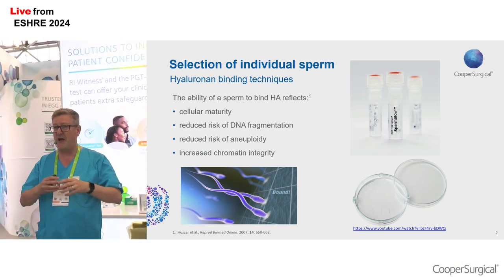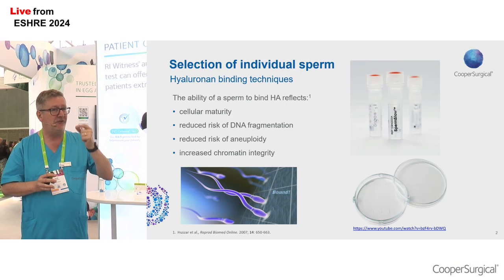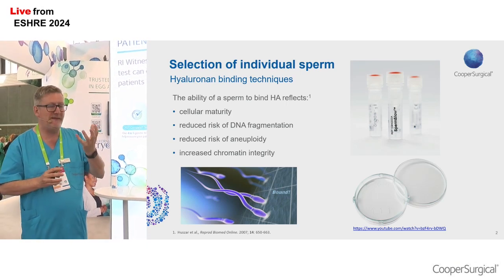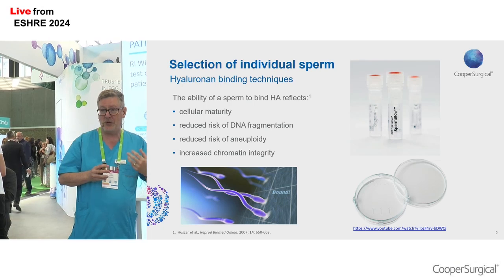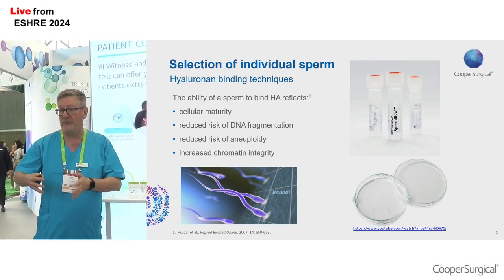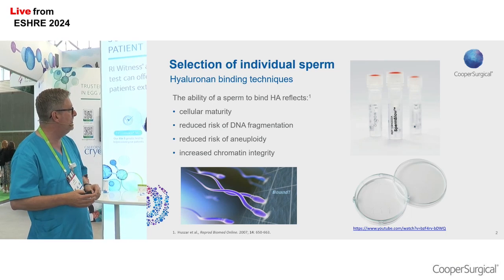SpermSlow is like a PVP. I don't want to present it as an alternative. It's a viscous, hydrated solution with a high concentration of hyaluronan that you use as a sperm selection device. But because it's viscous, it also helps with the handling during ICSI like PVP. So that's one way we'll do it, and Aaron will show you that in a moment.